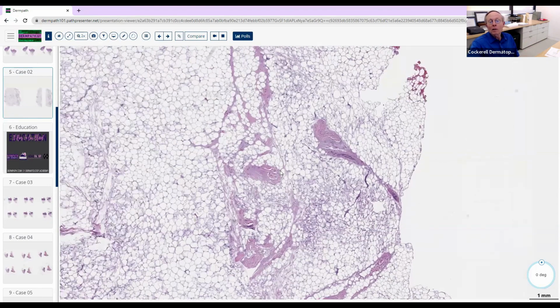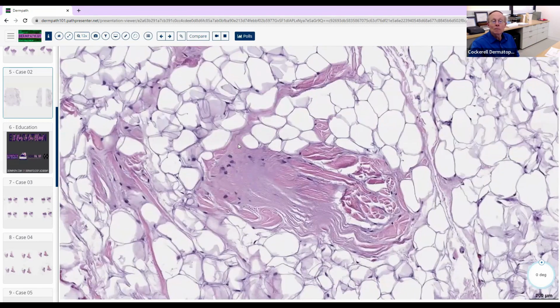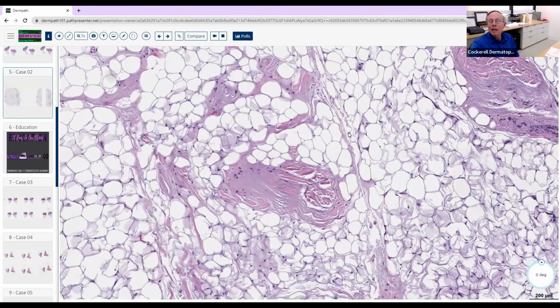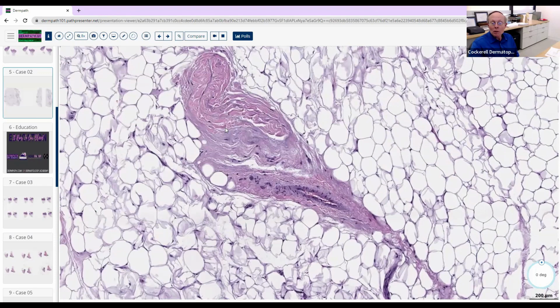And then there's this variant called a fibrolipoma. And you're right, you did identify these large aggregations of fibroblasts and collagen sitting in here. It's just yet another variant of a lipoma, not really super important, but just to recognize it as yet another one of the lipoma variants. I don't think they would show you this on the board because it's so boring.